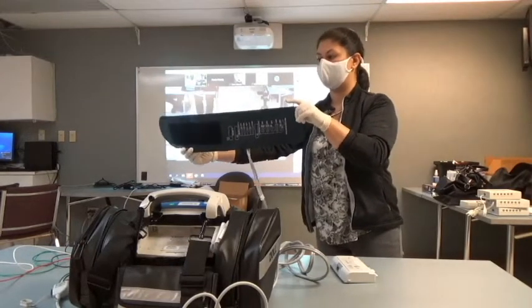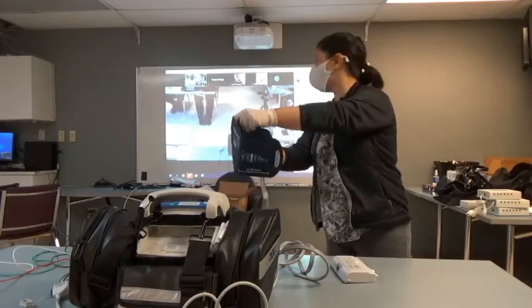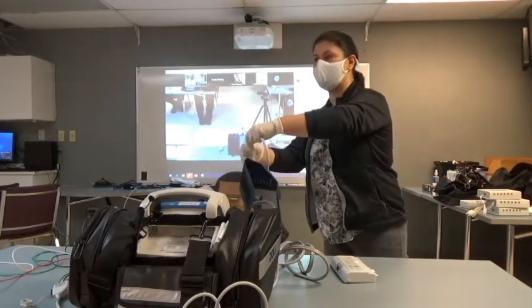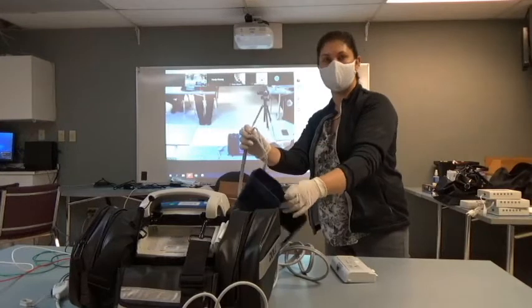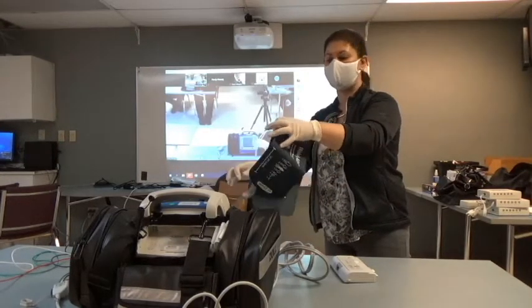But for everybody that's on Zoom, this is the part that we were talking about that we want to connect and disconnect from. And this is the area we would want to avoid because this plastic is really thin. If you guys do decide that you need to disconnect these because you need to clean it, just put it back wherever you think it's going to go. The monitor is going to figure it out on its own.